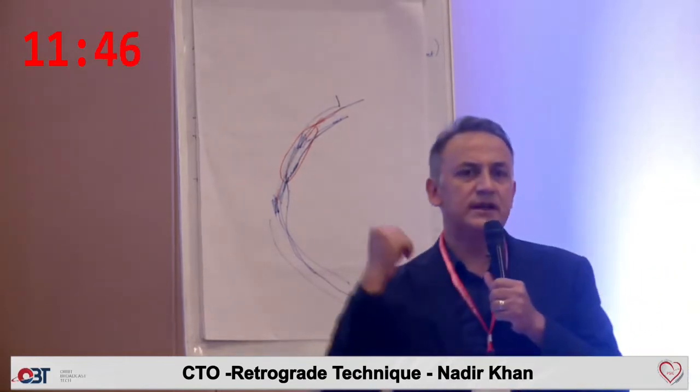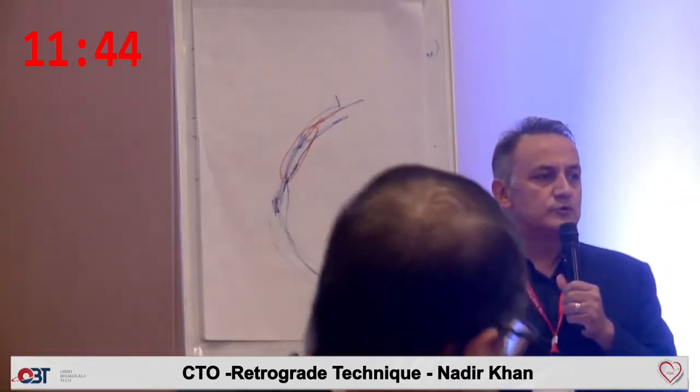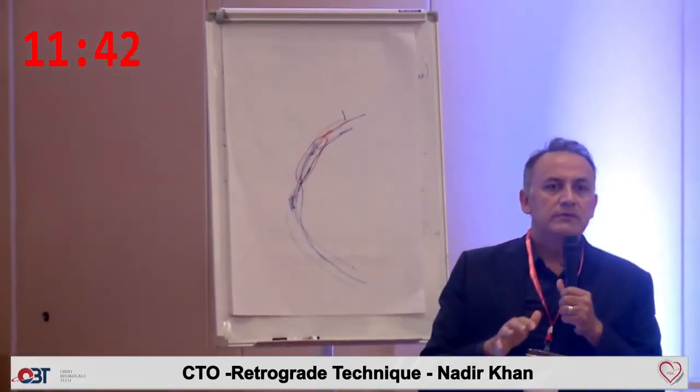Do you have any questions regarding this? Because this is very important to understand why we do ballooning. Just a simple question. If we balloon in the subintimal space or if we push a guideliner in the subintimal space, is there an increased chance of vessel perforation or any special precautions to be taken in ballooning in the subintimal space? No, not really.